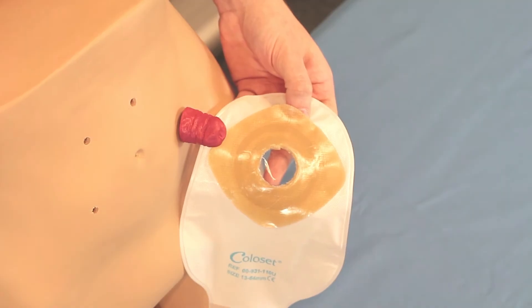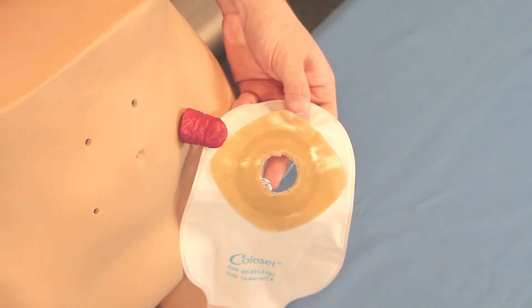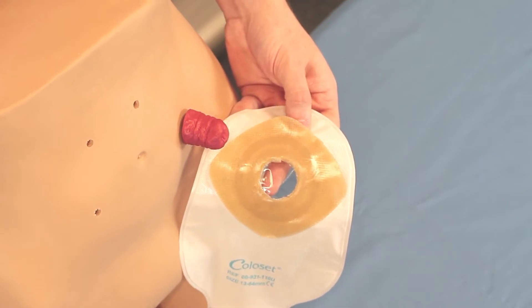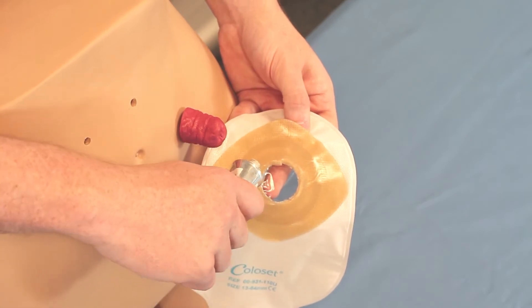Coloset Stoma Paste. For added protection with a barrier and pouch sealed to the body, you can use Coloset Stoma Paste. Stoma Paste fills in the gaps where there are folds in the skin or other bends in the anatomy.